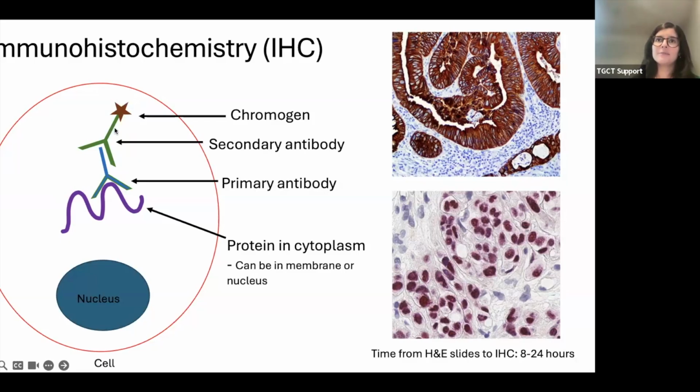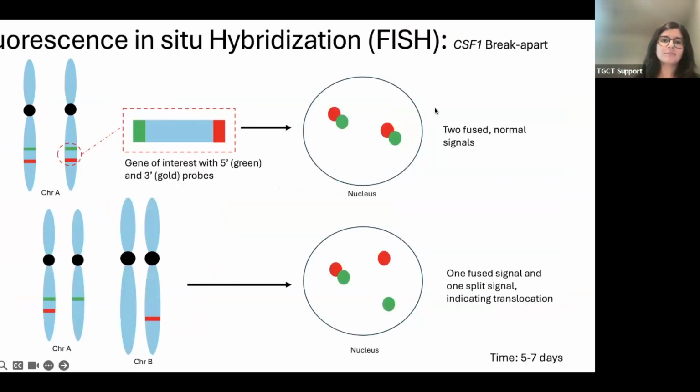And once you have both antibodies bound, essentially the chemical reaction releases a color. And if you have that protein, or if it's lost, depending on what you're looking for, that's what your IHC tells you. And so it'll have a nice color change. Generally, brown is the color that we like to use. It's easiest to see. And so if your protein is present, you'll get a nice color change, and the presence of that protein will be registered.